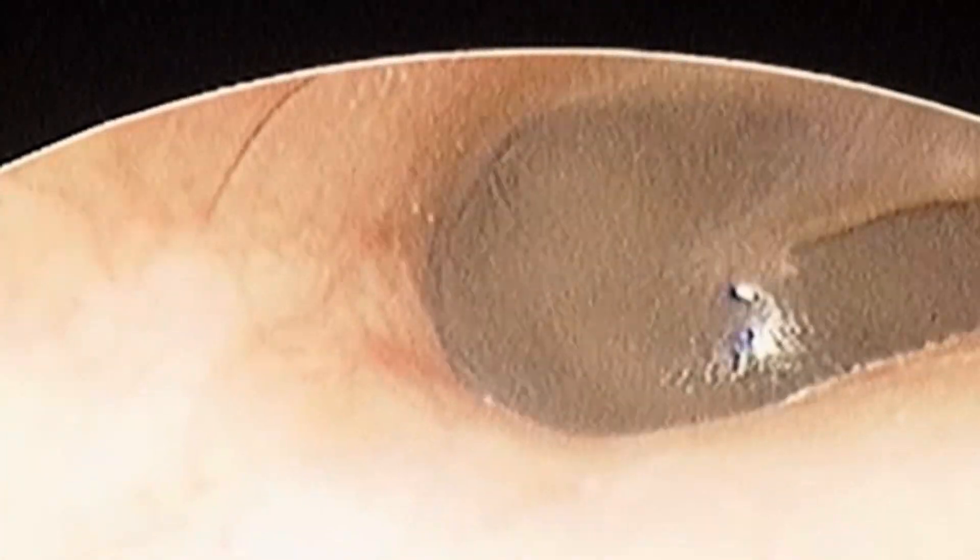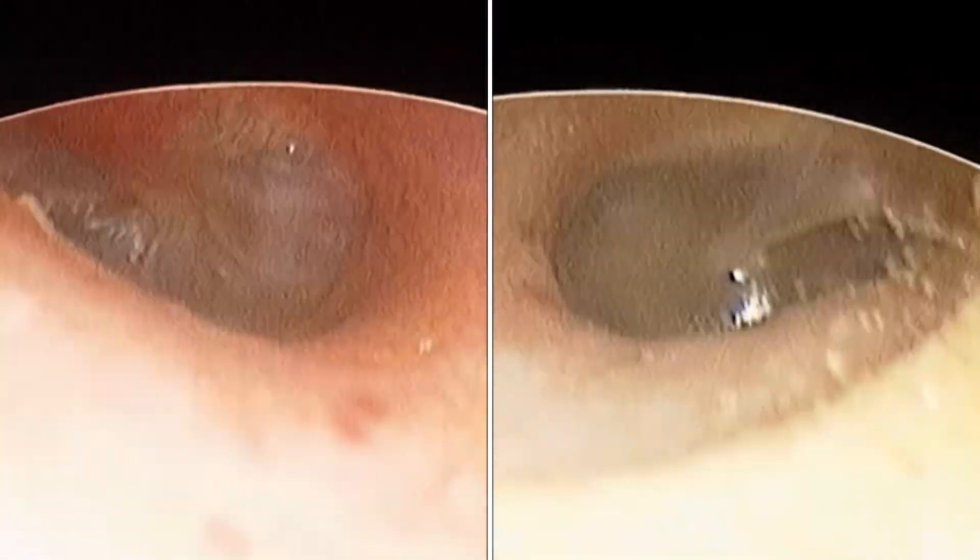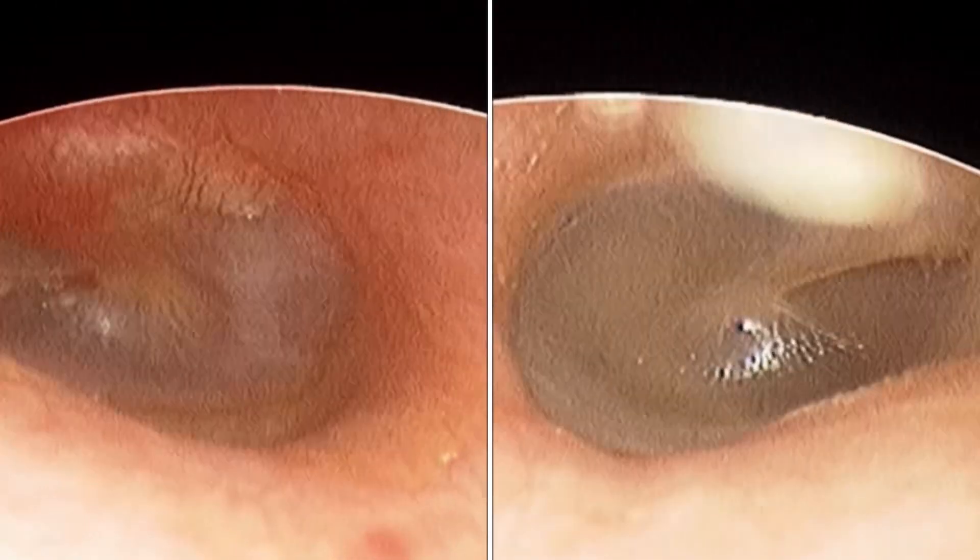I'm showing you a normal eardrum for comparison, and I will also be showing both the normal eardrum and the eardrum with fluid behind it side by side. The person with this condition feels blocked in the ear and may hear less.